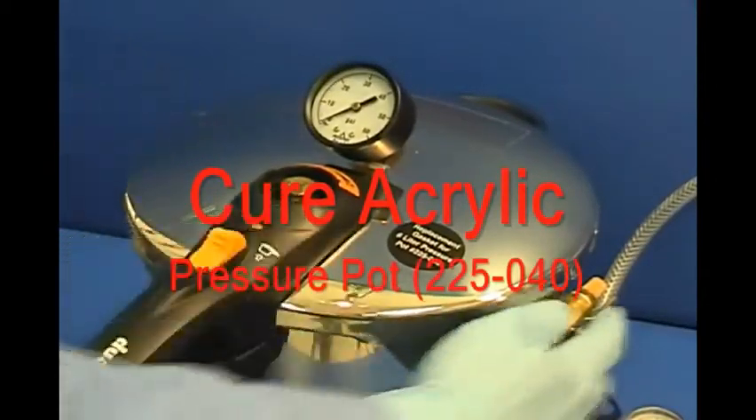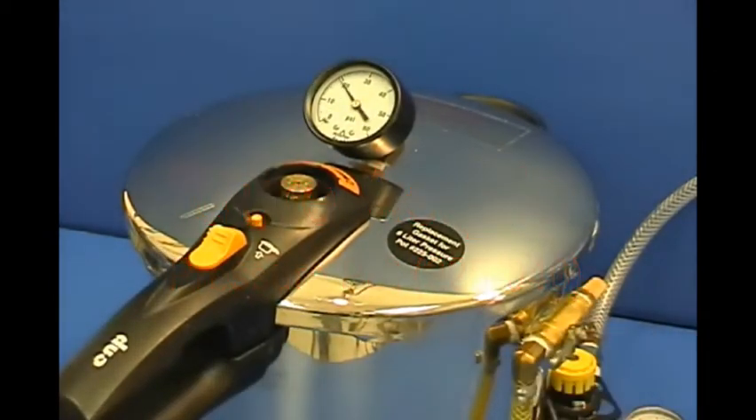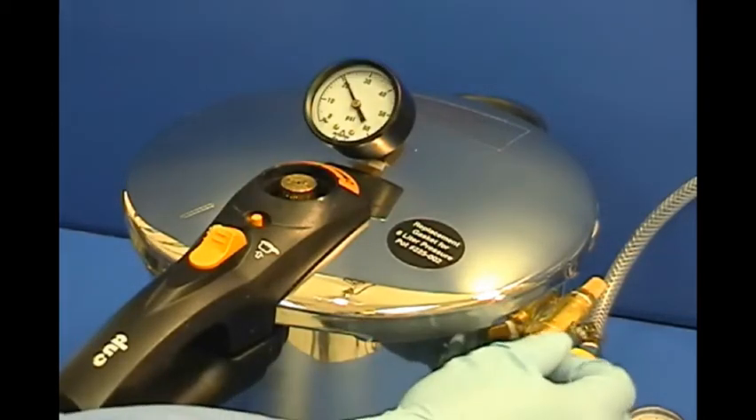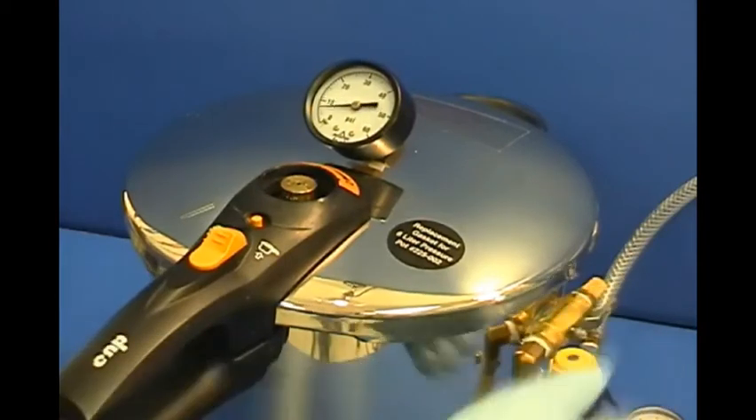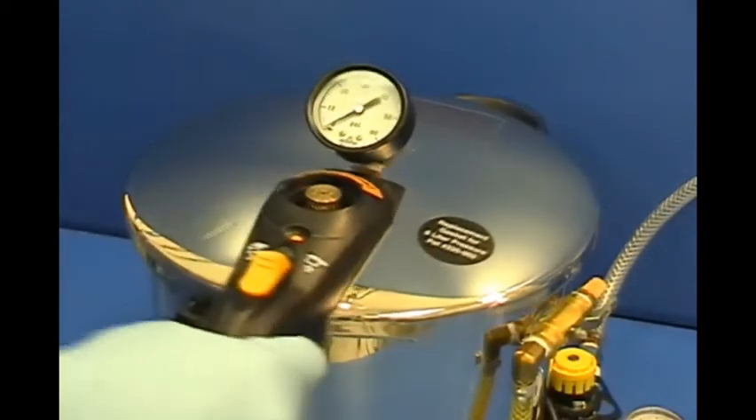Place the model and acrylic resin into a humid pressure pot for 15 minutes. Pressure should be adjusted to approximately 20 PSI. At the end of the curing cycle of the resin, evacuate the pressure from the pot and remove the model and cured acrylic.